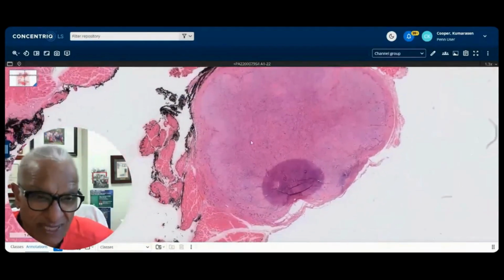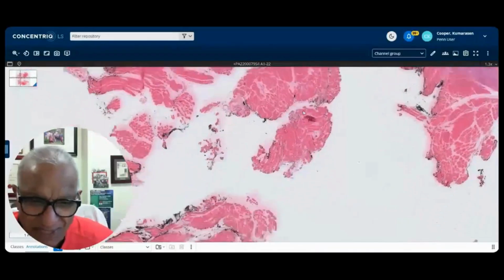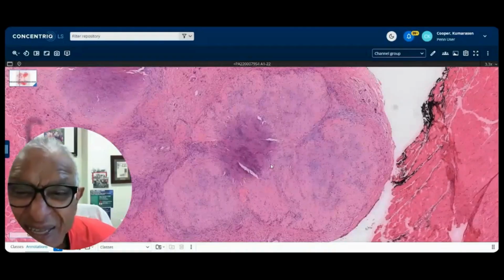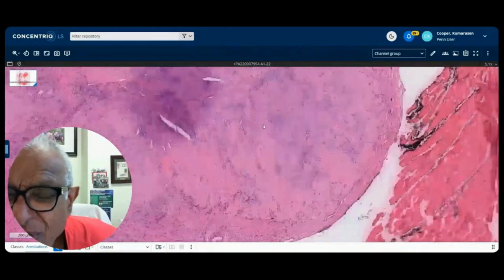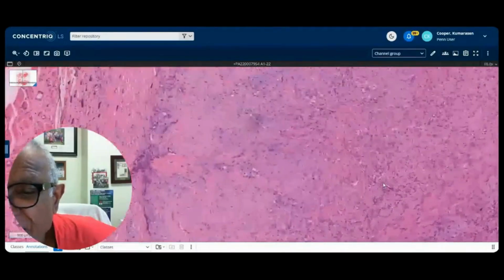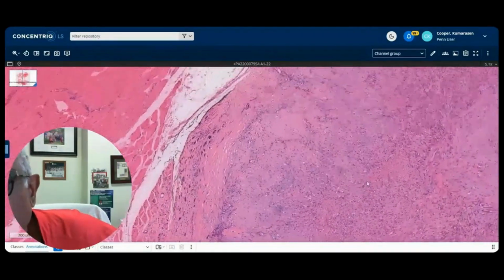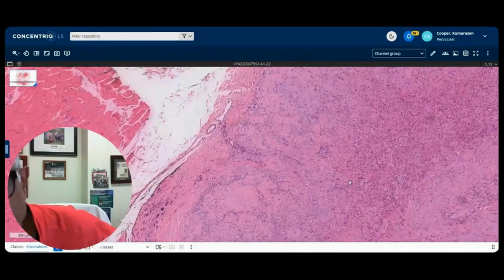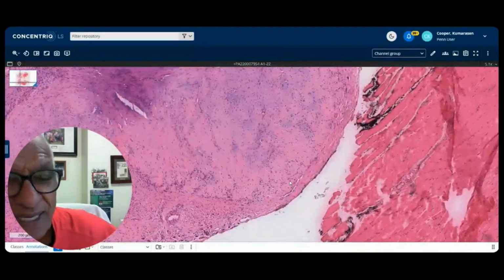So I did a USP6 because I thought this was a nodular fasciitis. It's deep. I've seen some of them being deep and have diagnosed some of them in the past. And the central parts look decent for that with the short fascicles, some of them looking cellular. There were a few osteoclast-like giant cells, which I just couldn't find as I was talking, trying to find them for you. But there's also sclerosis in the periphery as well. And the USP6 came back as negative.